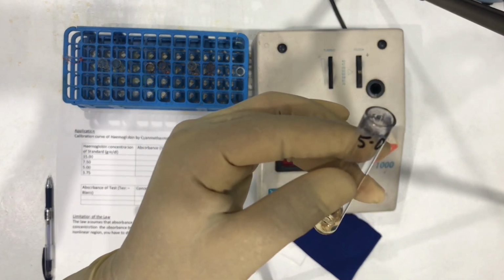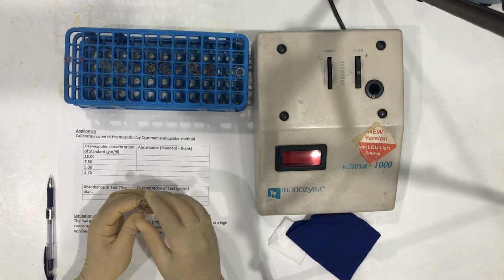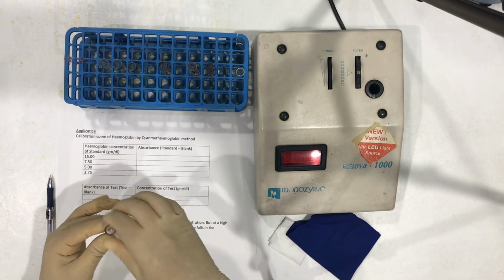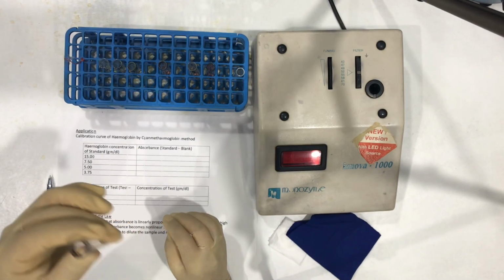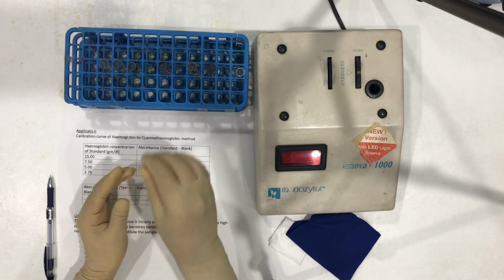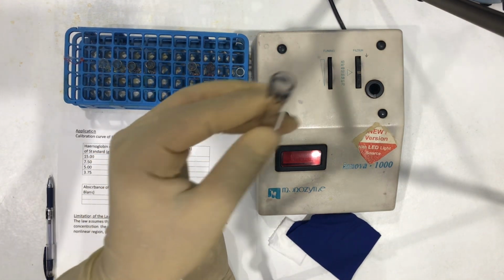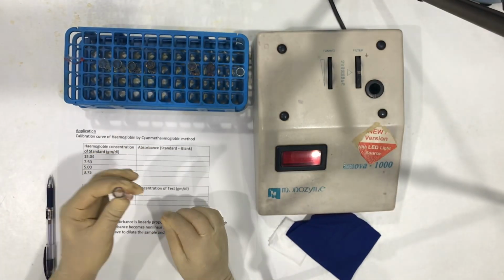This is our 5.00 standard. This is our 7.50 standard. This is our 15.00 standard.